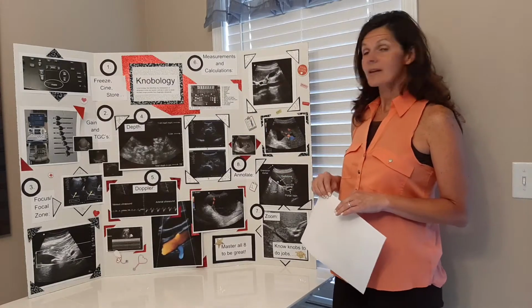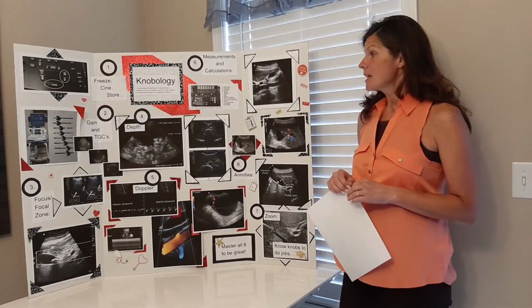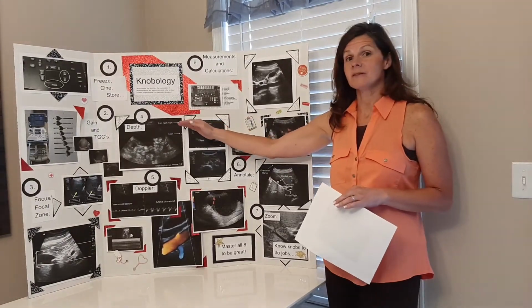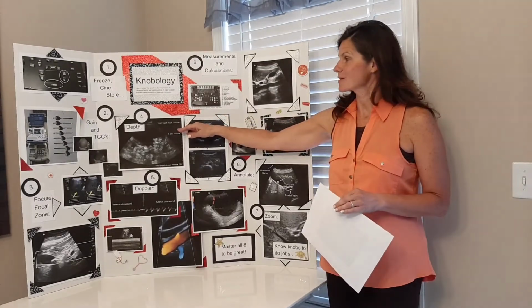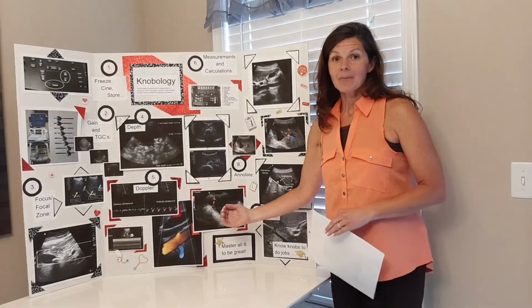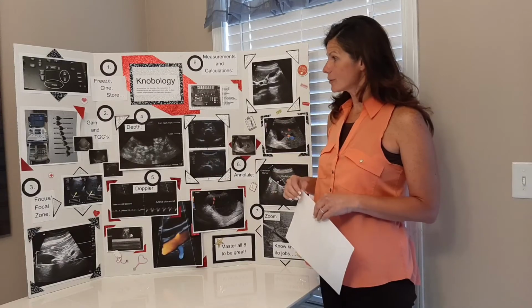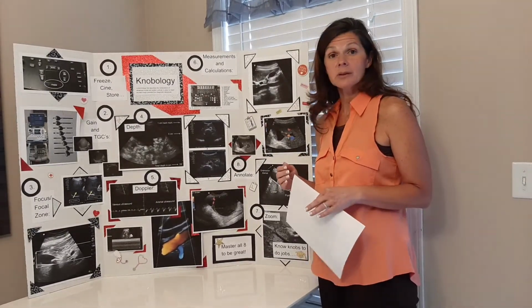The fourth button that you definitely want to know how to operate is the depth button. Depth shows you how far you are from the surface of the patient's skin. Obviously 1 centimeter is only 1 centimeter from the surface of the patient's skin, but 16 centimeters is deep inside that patient's tissue. Depth is important for radiologists to know, particularly if they want to drain fluid for a paracentesis.